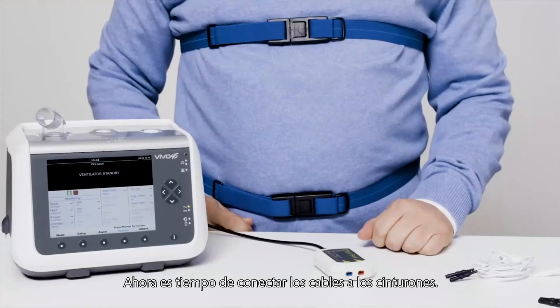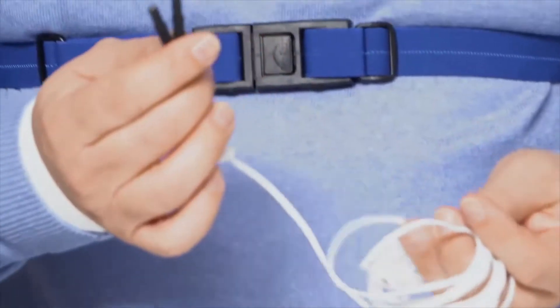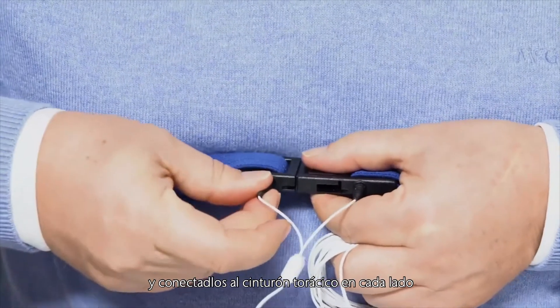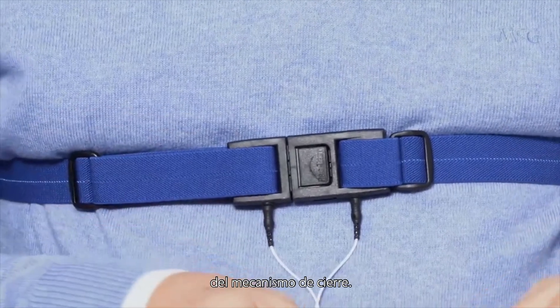Now it's time to connect the wires to the belts. Look for the two black connectors on the white wire and connect both of them to the thoracic belt on each side of the closing mechanism.